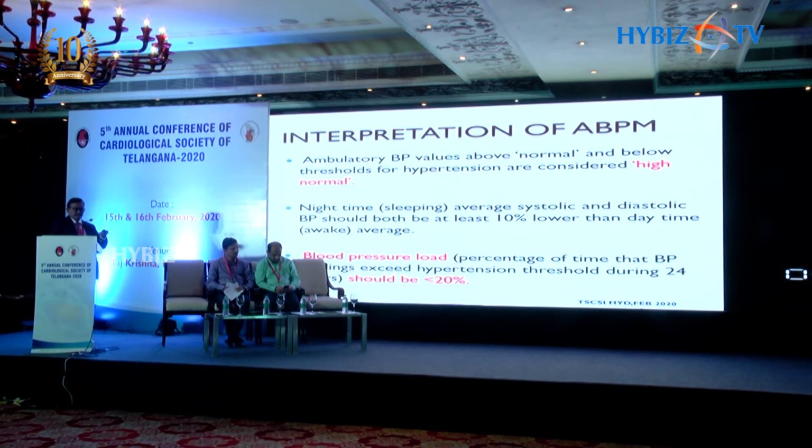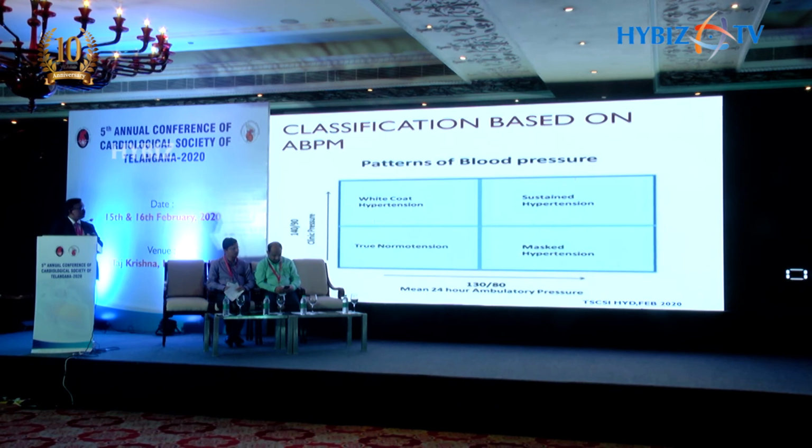Why should we take an ambulatory blood pressure at all? The blood pressure load, as I was telling, can also be calculated by this. And this is the crux of ambulatory blood pressure monitoring again.